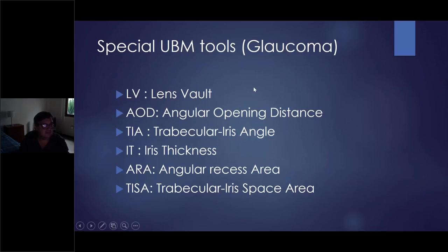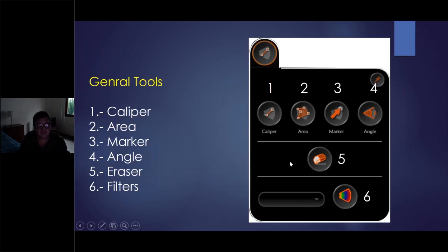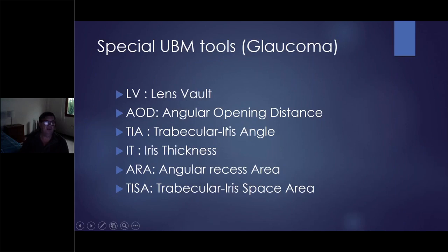And this is for me the most important part because I am a glaucoma specialist. Then you have the lens vault, the angle opening distance, the trabecular iris angle, the iris thickness, the angular recess area, and the trabecular iris space area.